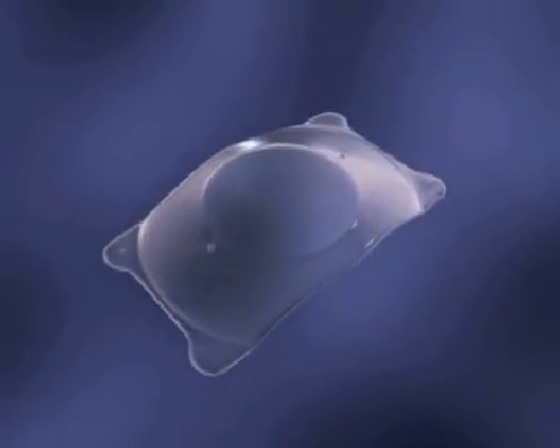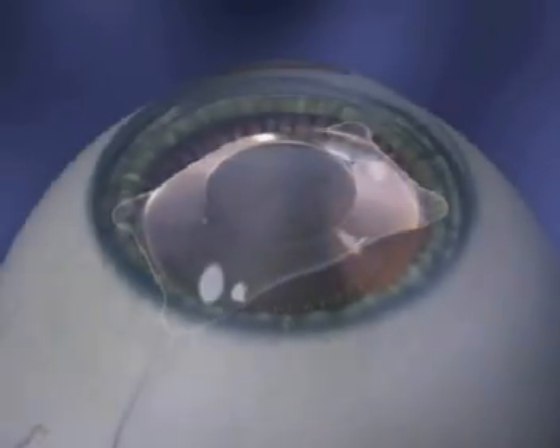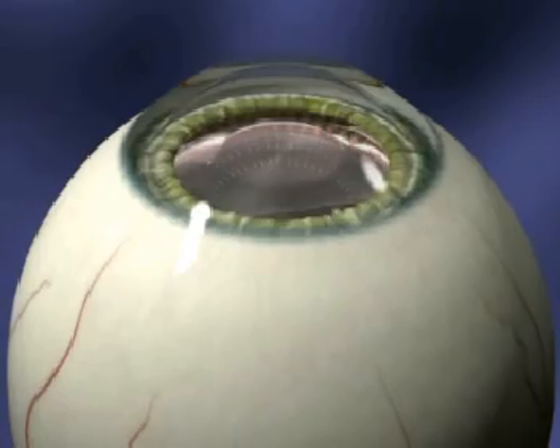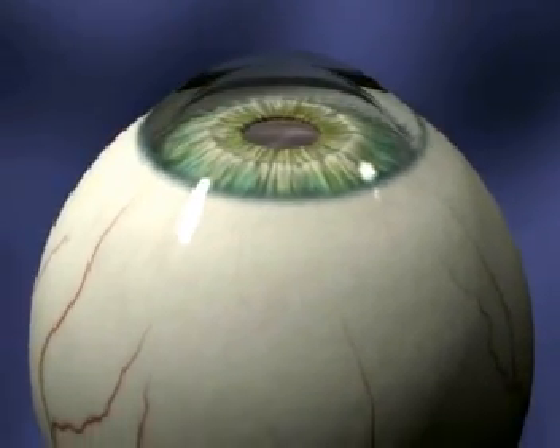This is an animated guide to implanting the Star Vizion Surgical Implantable Contact Lens, or ICL. Remember, in cataract surgery, the crystalline lens is removed. In ICL surgery, the crystalline lens is preserved.